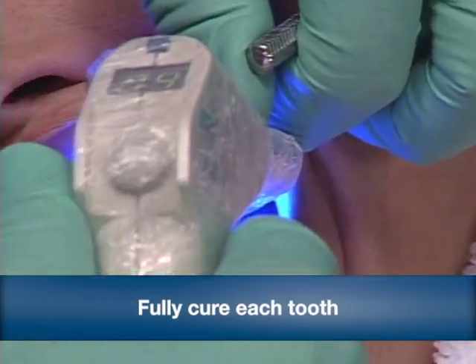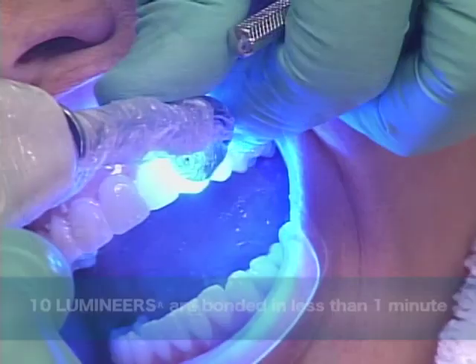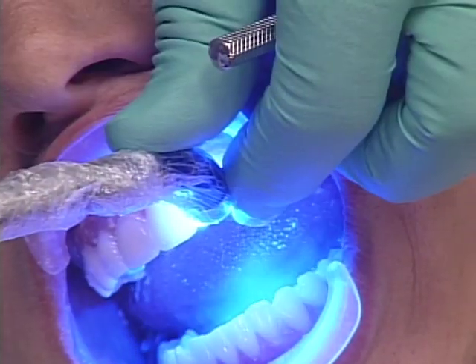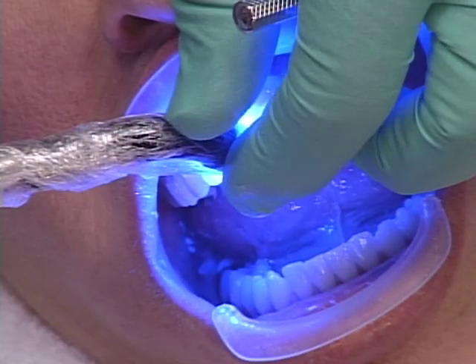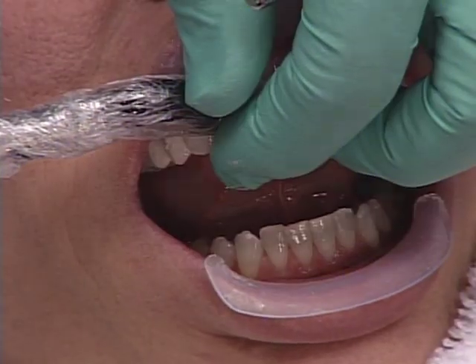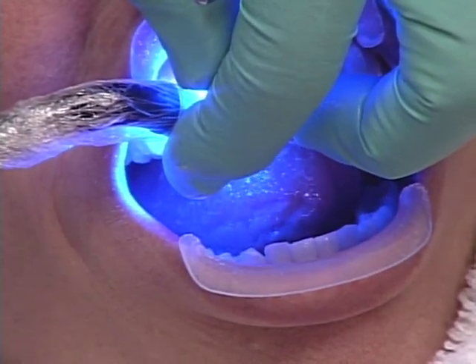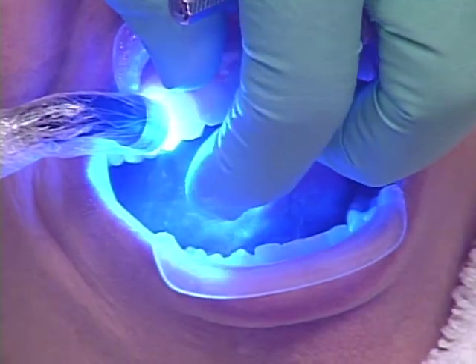So we go on each tooth for 5 seconds. And if you multiply 5 times 10, that's 50 seconds. Now the advantage to this is that the less time I have to protect this from being moist or being contaminated, the better. So I want to get in and get out. Close your eyes. And I don't cure on the lingual side, I just cure on the labial side.